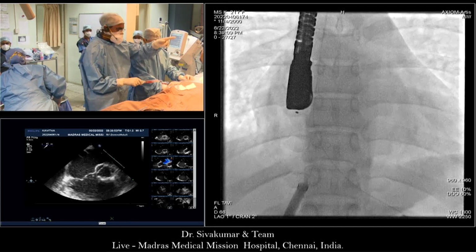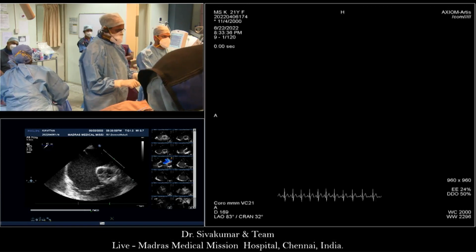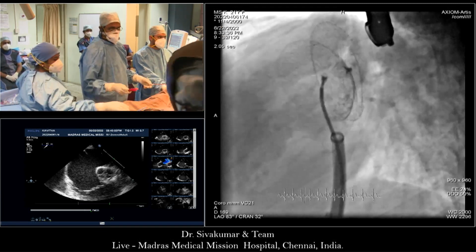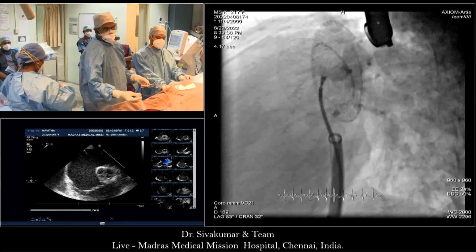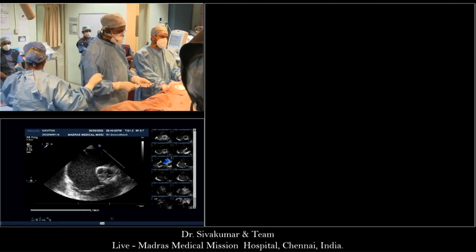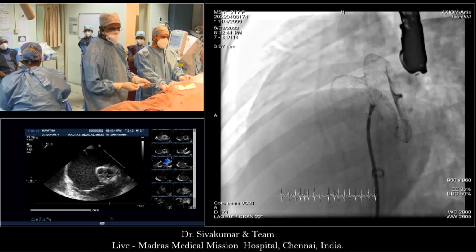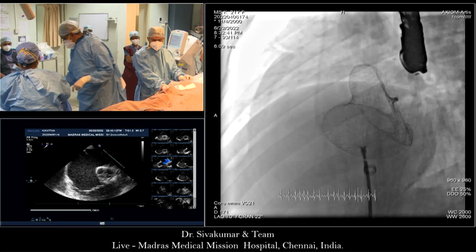Show me that LEVO picture. LEVO picture. Nick, come to the microphone. Show me the place where the So now that he's taken it out, you've made him take it out. What size do you suggest he tries? Well, we had the 32 millimeters in measurement.